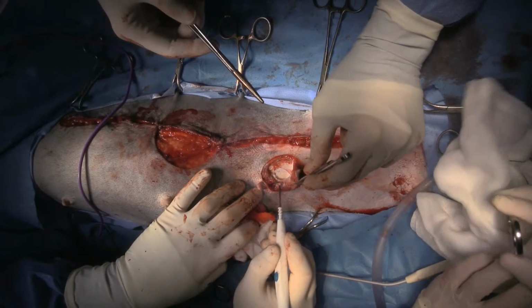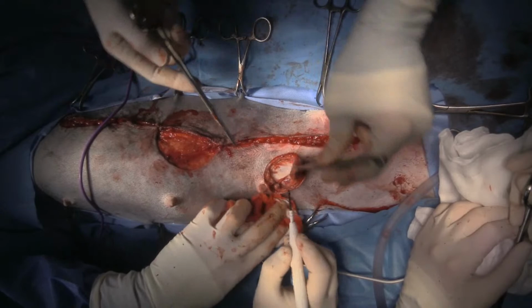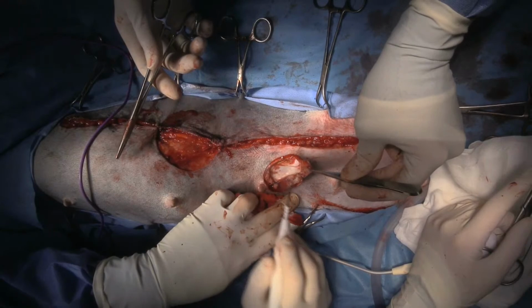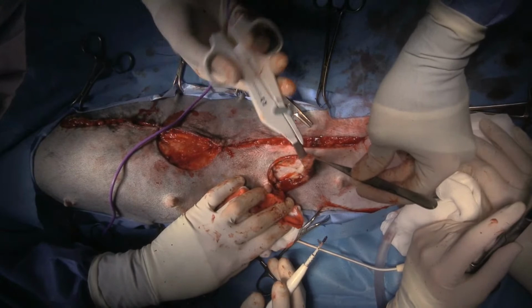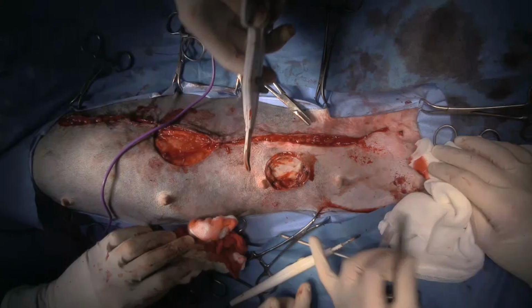A little bit wider. Not there yet. I'd probably use cut rather than coag. And cut with the edge. Yeah. Just make sure that we got it in here. Yep, we did. I'll have to submit that separately. Yeah.